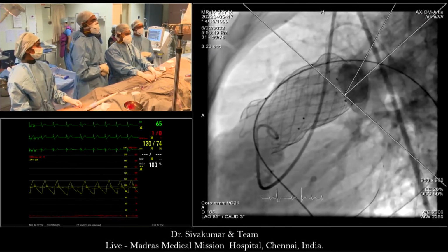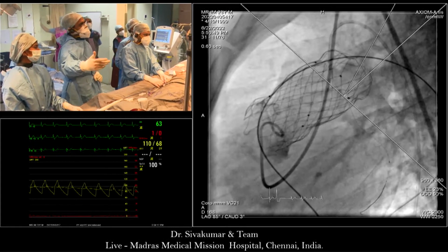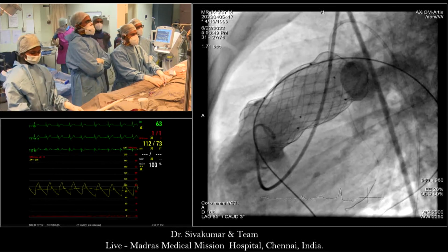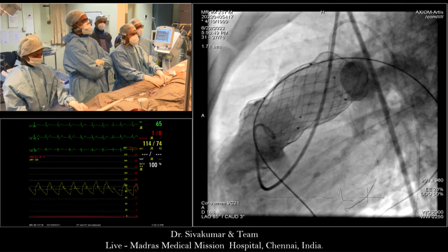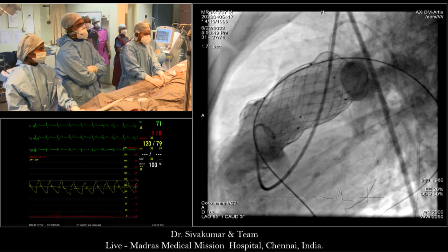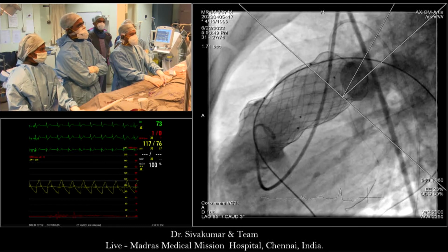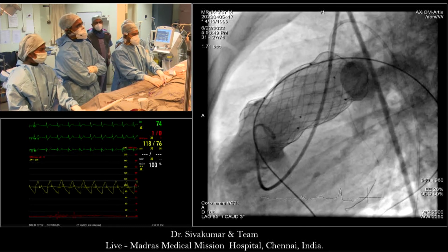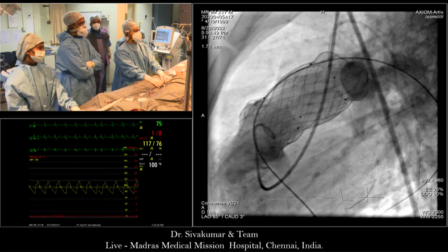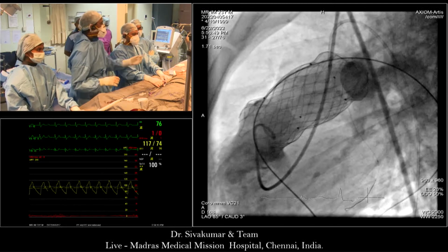If you freeze the picture when the angio is seen. Stop. Yep. You see that oval shape? Yeah, right contrast, pulmonary artery. So that's the right pulmonary artery going into the picture. And if you then match that against the distal flare, the distal flare is just partly covering it, but it's much more proximal than it was originally. So I usually use that RPA as a good guide. Come to AP.